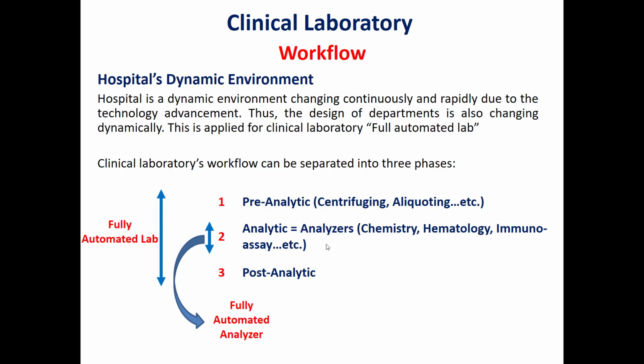So the automation was only related to the analytic phase, whereas in the new environment, the fully automated lab, the automation is now related to the three phases: the pre-analytic phase, the analytic phase, and the post-analytic phase. So now it's essential, in addition to the study of the analyzers, to study the automation in the pre-analytic phase and the post-analytic phase.